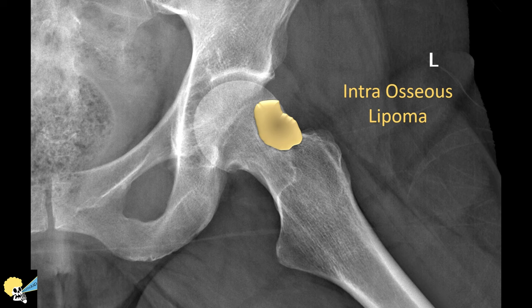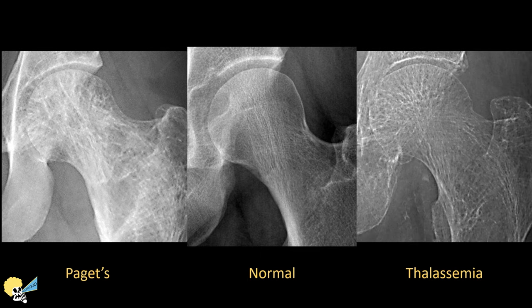Finally, we have side-to-side comparisons of patients with true thickened trabeculae as in Paget's disease, a normal patient with normal trabeculae, and a patient with thin trabeculae in the background of poor bone mineralization. Obviously, when you look them side by side, it's quite simple to spot the differences. So, trabecular patterns — now you know!